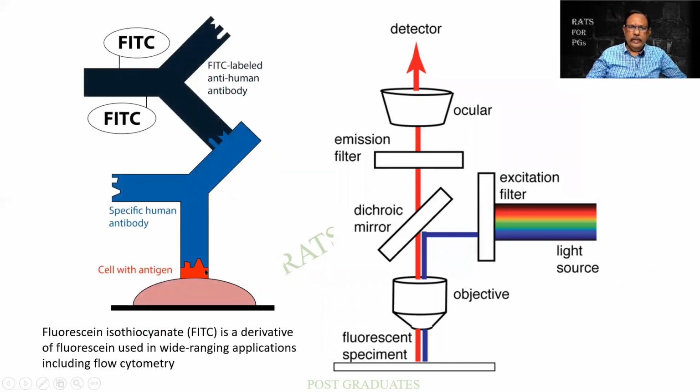That is over here. So this is a primary antibody, there is a secondary antibody, this is a label. And what is that label called? Fluorescein isothiocyanate. Please do mention that. What is the coloring substrate? You will have to mention.